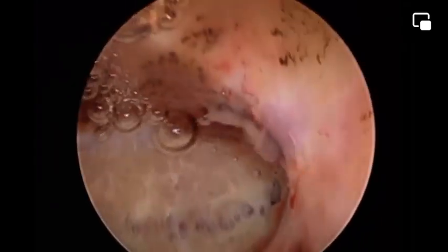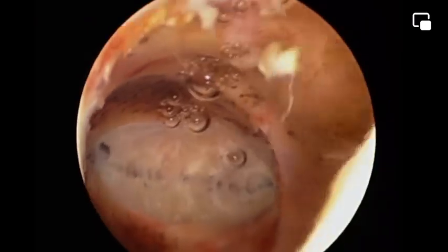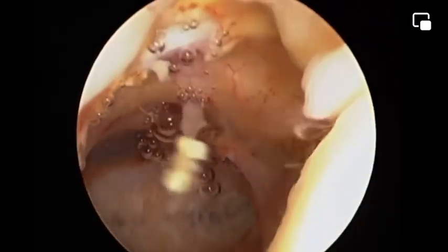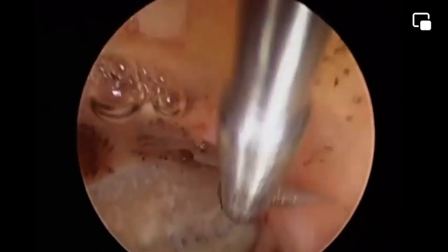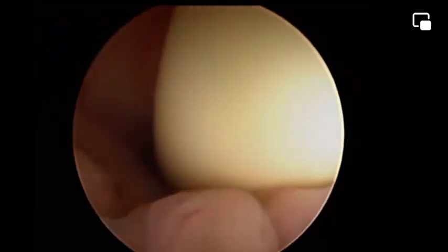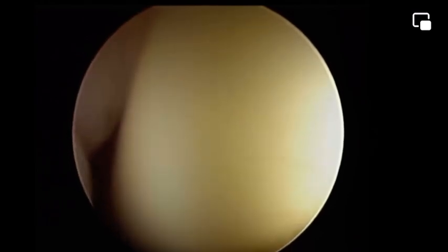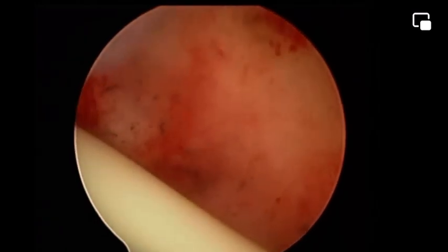In fact, dealing with this central adhesion very much looks like a uterine septum because it is thick, broad, and extends from one ostium to the other ostium. So the maneuver and the technique look exactly like the incision or release of a uterine septum. Because of the poor endometrium and the possibility of recurrence of adhesions, it is advisable to put a physical barrier to prevent coaptation of the walls of the uterus and to prevent reformation of the adhesions.